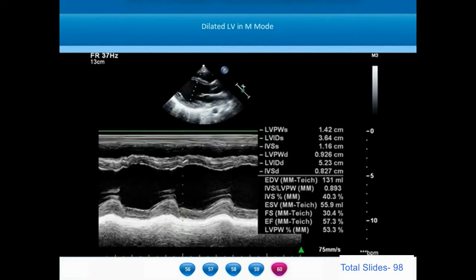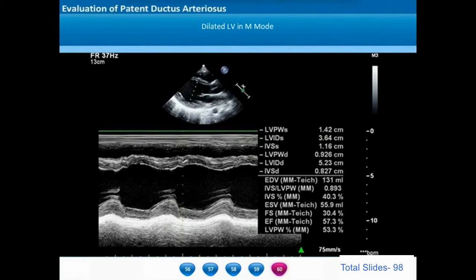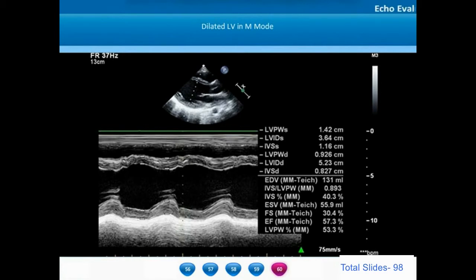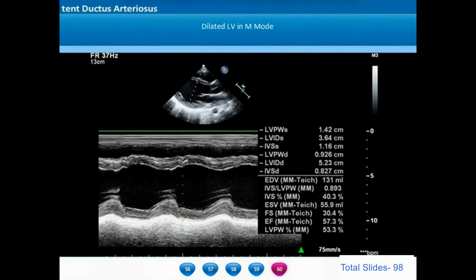Dilatation of the left ventricle is indirect evidence of the magnitude of left-right shunt through the ductus arteriosus. If there is a large left-right shunt, it results in significant LA-LV dilatation and large left ventricular internal dimensions in diastole. In this M-mode taken from a small 1-year-old child, the left ventricle internal dimension is as large as 5.23 cm — an indicator of significant dilatation due to large flow from the aorta into the pulmonary artery through a large ductus.